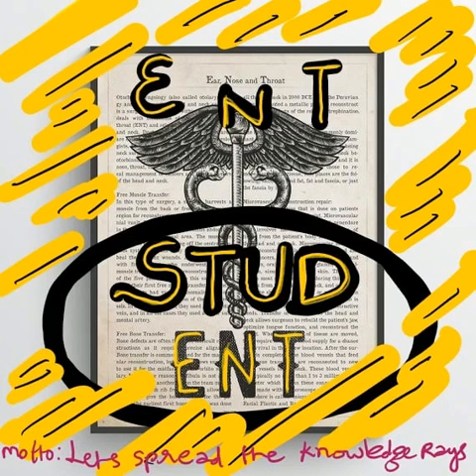Cortical mastoidectomy. Cortical mastoidectomy is exenteration of all accessible air cells of the mastoid bone.